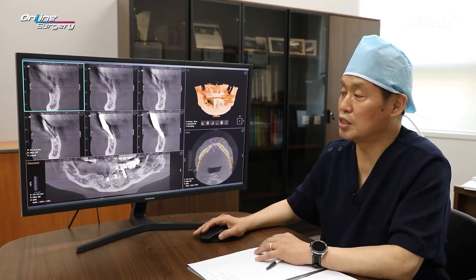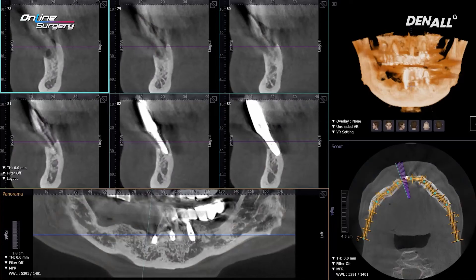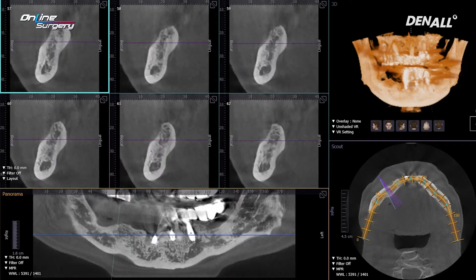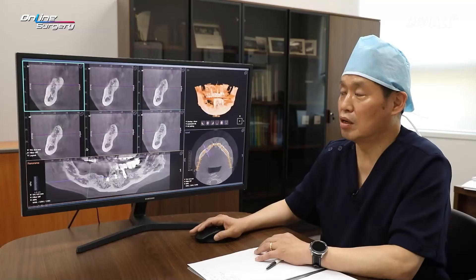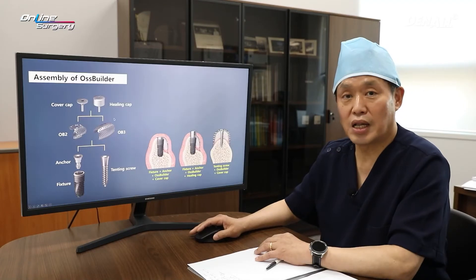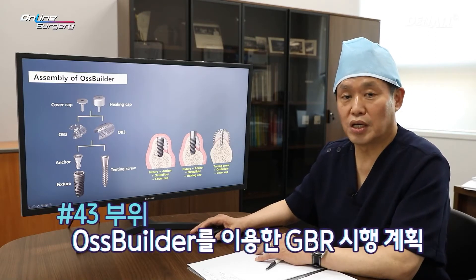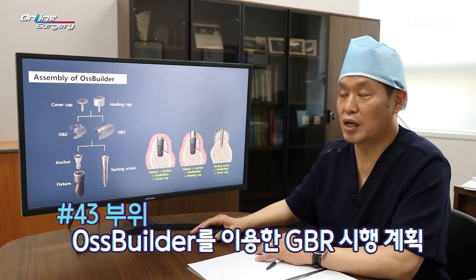After one month, after extraction CT was taken. In number three, a lot of alveolar bone is missing, and GBR is anticipated to be necessary. In number six and number seven, there was a rather good amount of alveolar bone. On the canine, I'm going to use the OzBuilder for GBR. That was the plan.